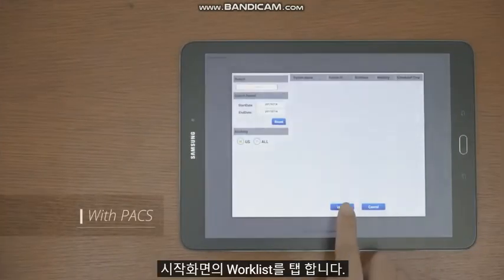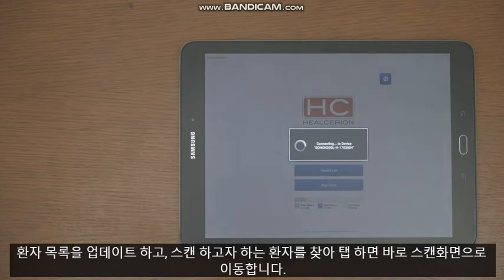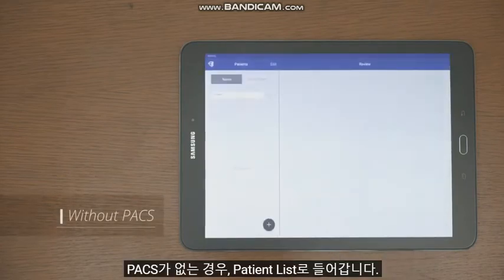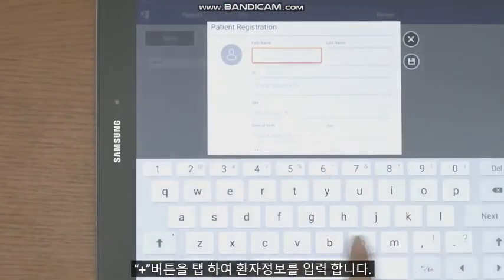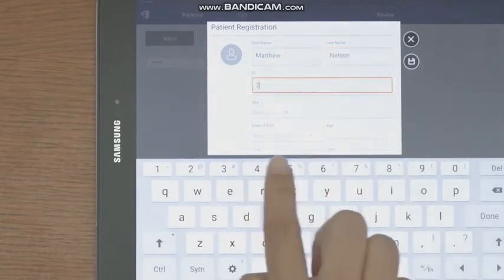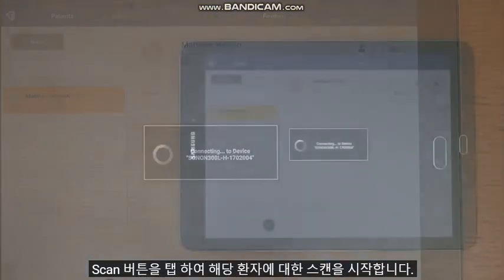Tap the worklist on the start screen. Update the patient list and find the patient you want to scan. When ready, tap to go directly to the scanning screen. When PACS is unavailable, go to Patient List and tap the plus button to enter patient information — patient name and ID are mandatory. Then tap the scan button to start scanning for that patient.